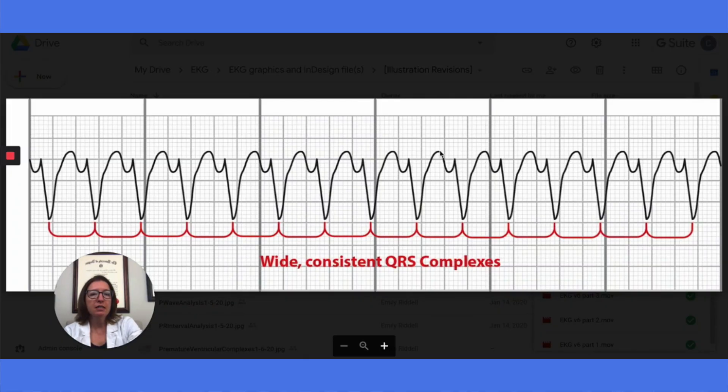In terms of heart rate, if I measure the distance between these QRS complexes, there's about 10 small boxes between them. So 1,500 divided by 10 is 150 beats per minute. We're definitely experiencing tachycardia here.